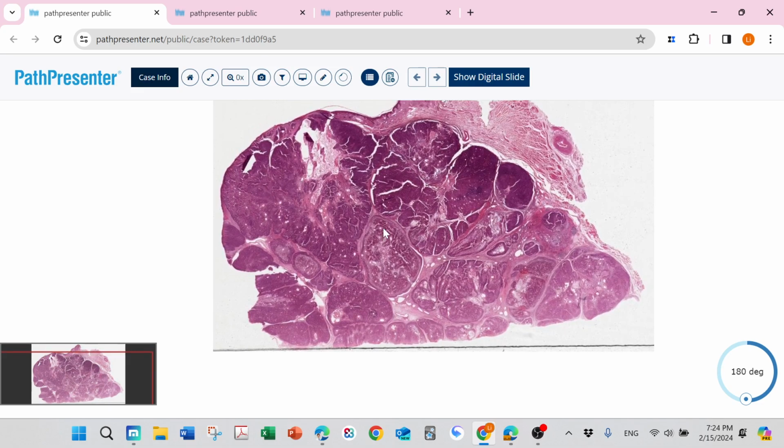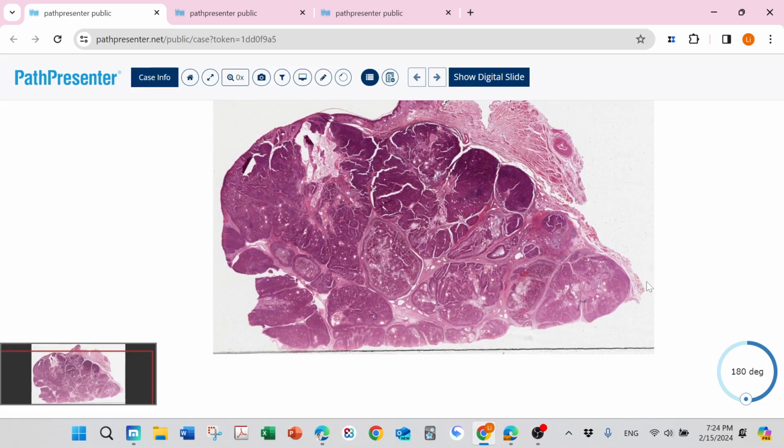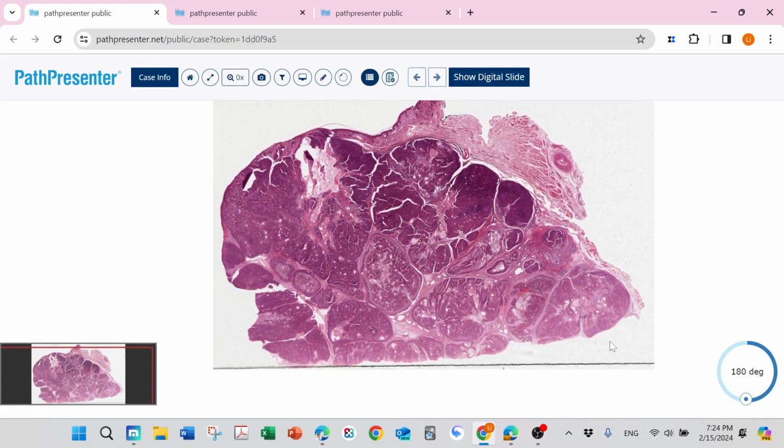So this one is sebaceoma. Then we have this sebaceous carcinoma. This lesion is really big. Even in this part, we can see the lesion kind of dissected, so you can estimate this is a really infiltrative lesion. It is really dark, really hypercellular, hyperchromatic.